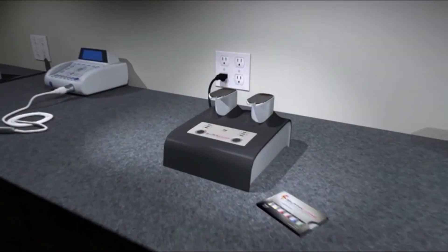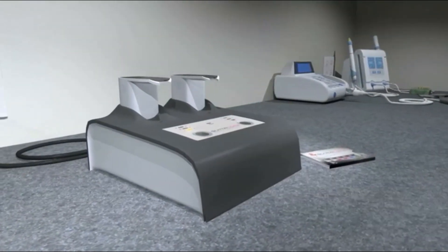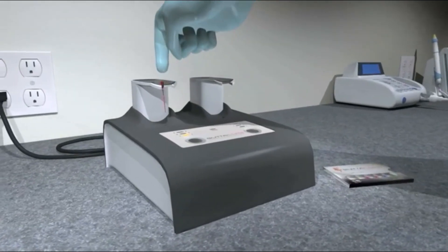After performing your final irrigation, turn the oven on by holding the size button until lit. Disinfect your obturator, set its working length, and place in the oven arm.